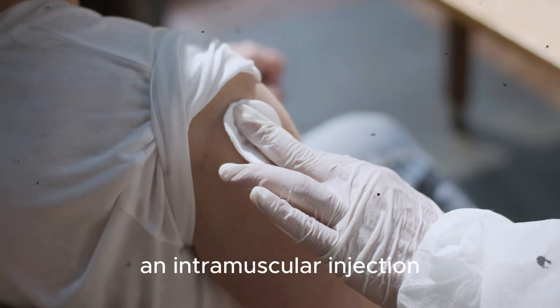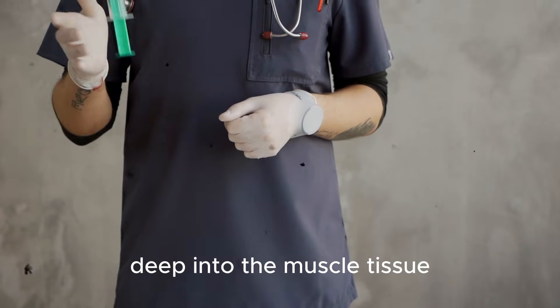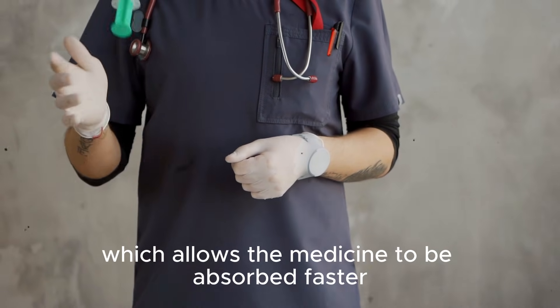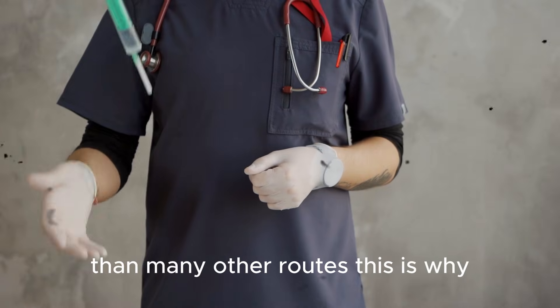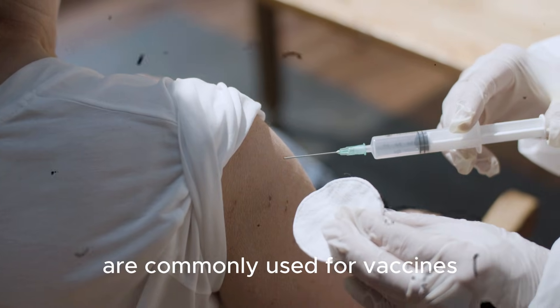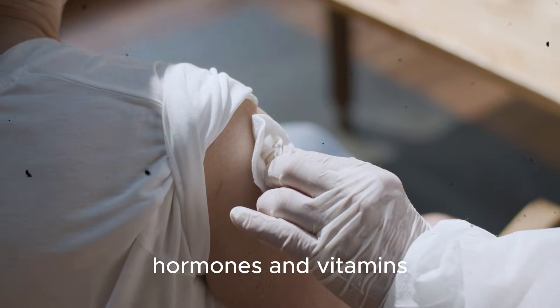An intramuscular injection is a method of delivering medicine deep into the muscle tissue. Muscles have a rich blood supply which allows the medicine to be absorbed faster than many other routes. This is why intramuscular injections are commonly used for vaccines, pain relief medicines, antibiotics, hormones, and vitamins.